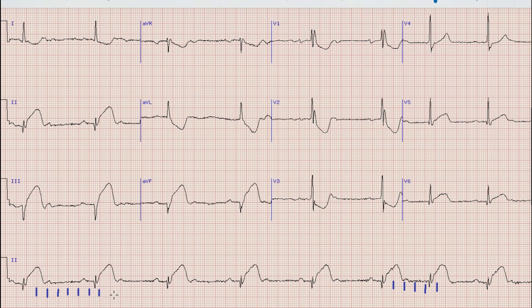The heart rate is about 55 at the beginning of this rhythm strip while it is around 65 at the end of the strip. This means that there is some abnormality causing this change in heart rate.